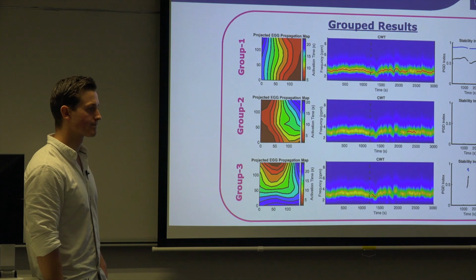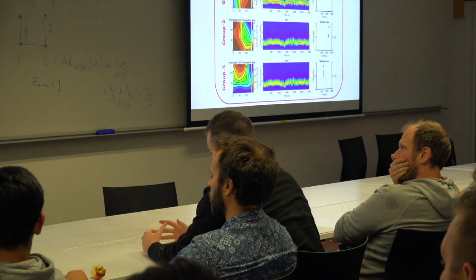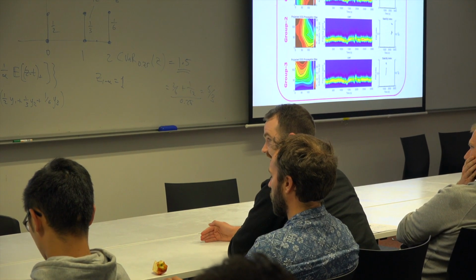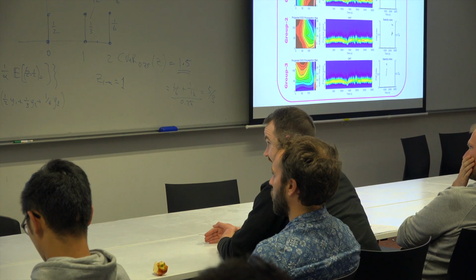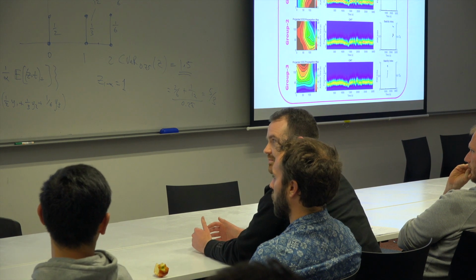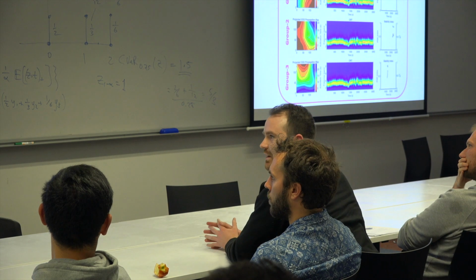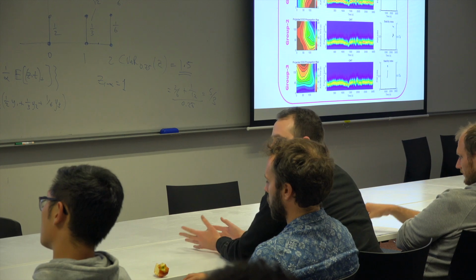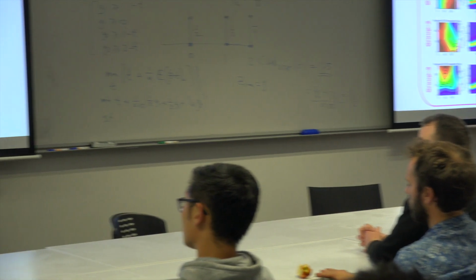Thank you. You just mentioned how you think about the serosal information as a projection on what you're measuring in the EGG. So how can you make sense of velocity and directional information in your human participants, because unless you've measured it, the actual orientation of the stomach will change, right? Do you need to measure that before you can make sense of velocity and directional information? This is up for debate.